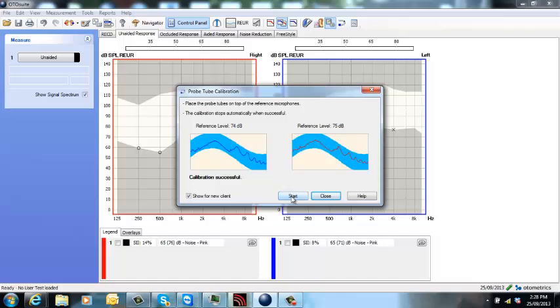So here we've got calibration successful. If it's not successful or if it's quite peaky, just check the probe tubes aren't blocked and that the FreeFit is nice and stable whilst you're performing this measure.